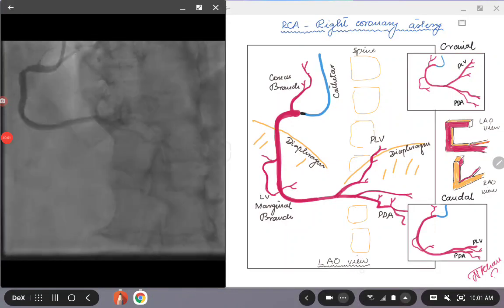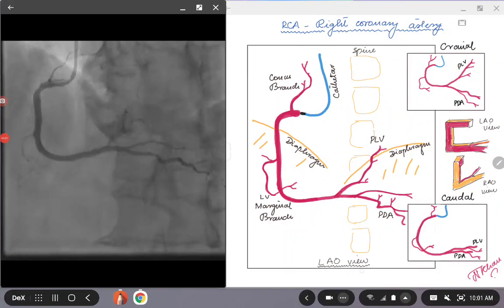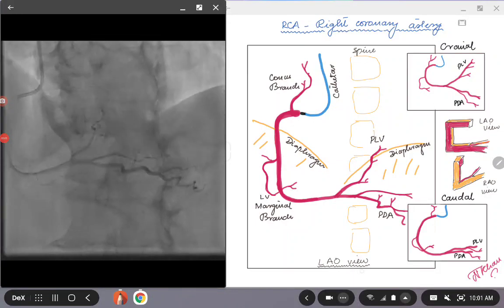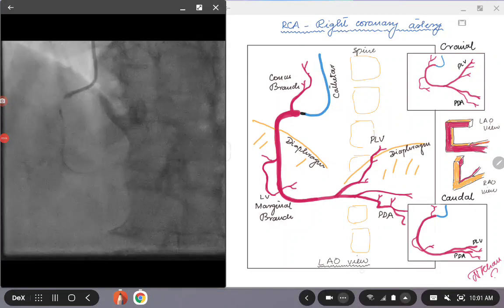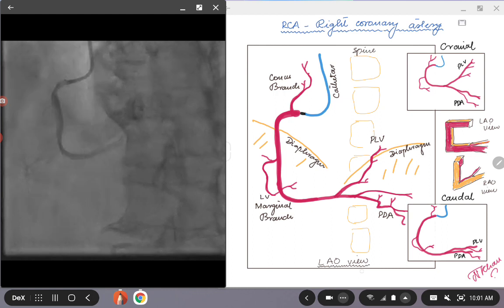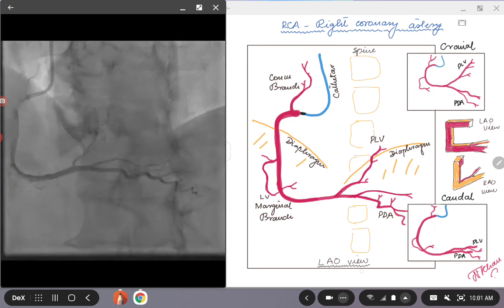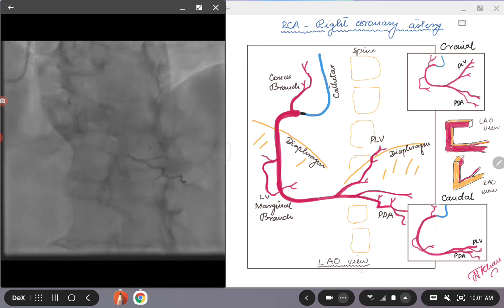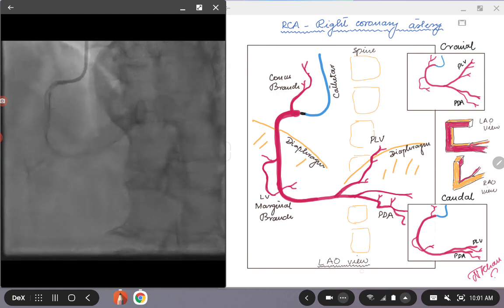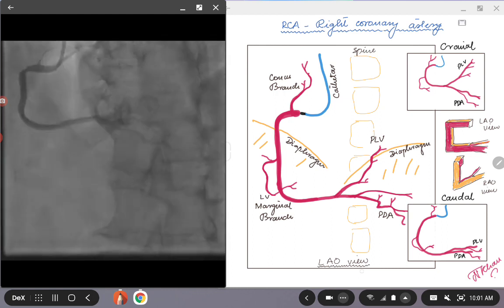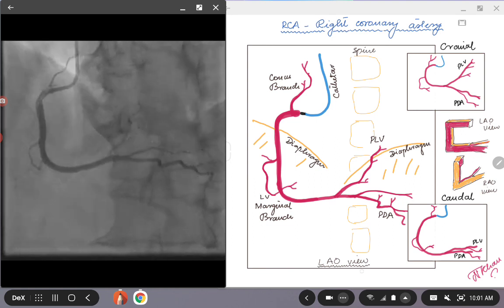Hello everybody, today we are going to talk about the right coronary artery angiogram and how we recognize the right coronary artery on the angiographic films.